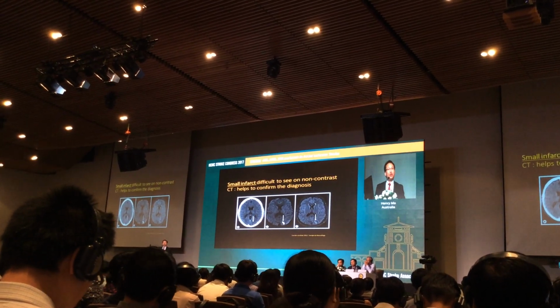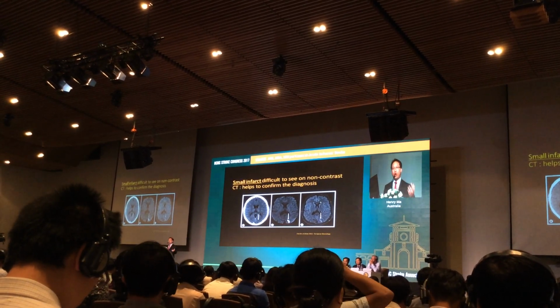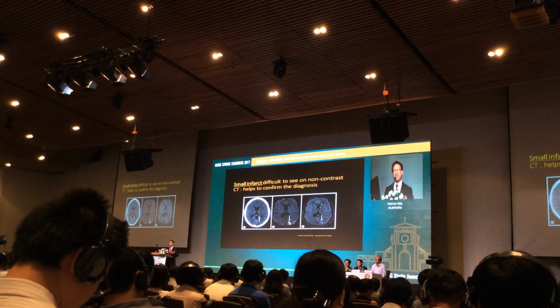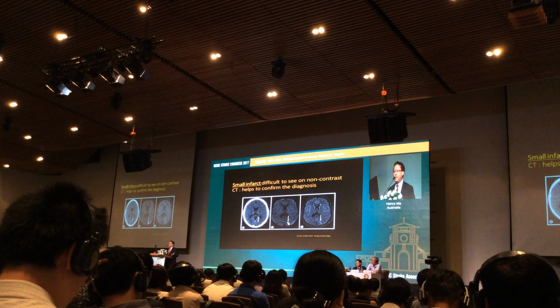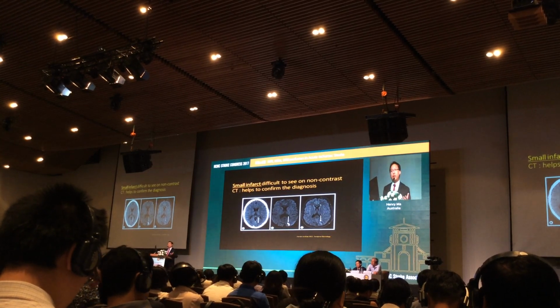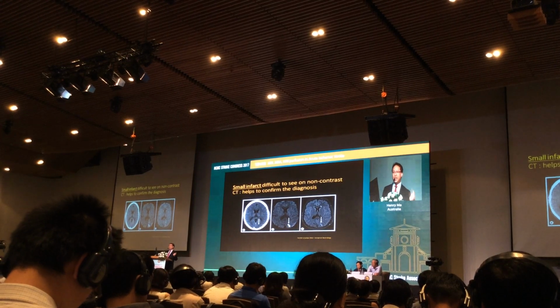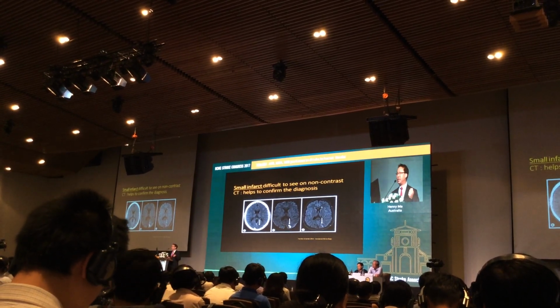So a lot of you do non-contrast CT. You've got a patient in front of you with a non-contrast CT, 45, with a bit of a psychiatric history, you think, well, maybe functional. I'm not so sure this is real. On a CT, you can't see anything. But you do a hot DWI, you put them in the scanner straight away. A DWI sequence takes 60 seconds.